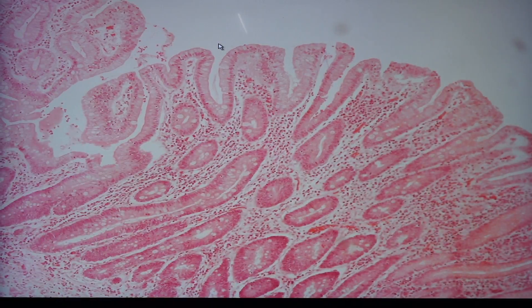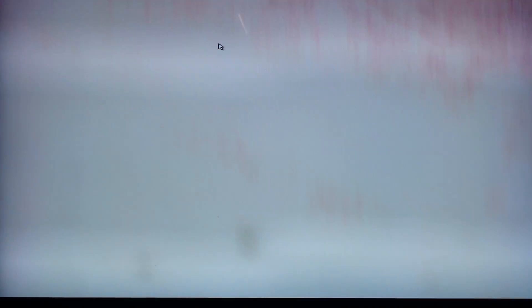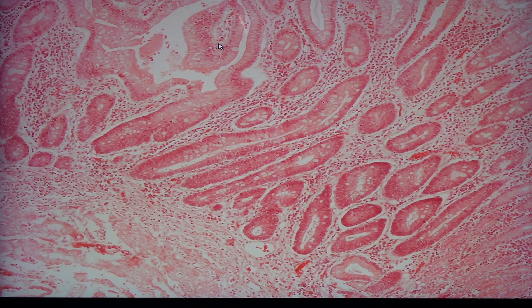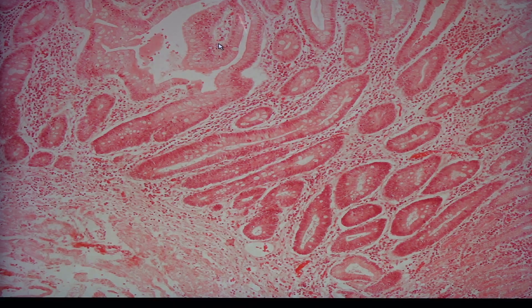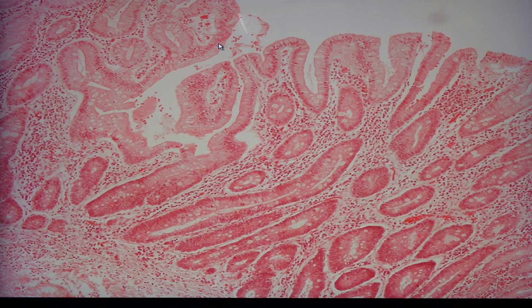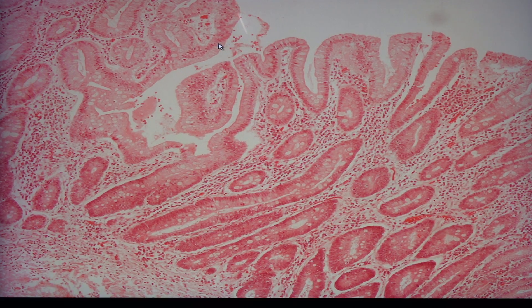Next we have slide 101, which is chronic gastritis. Chronic gastritis would be associated with Helicobacter pylori infection and autoimmune gastritis, although there are other causes. Those two are the most common. Patients would complain of nausea and upper abdominal pain, which are the typical symptoms. An uncommon symptom would be hematemesis.